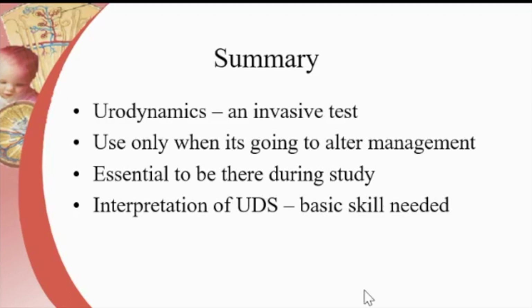So to summarize, urodynamics is an invasive test, and it is used only when it is going to alter the management, and it is essential to be there during performance of the study in a child. And interpretation of the urodynamics is a basic skill needed for a urologist. So I'll finish with that note.